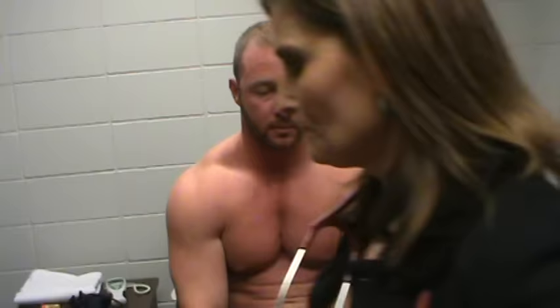All right, we've looked in your ears. Now what I want to do is a couple tests just to determine whether you've had any hearing loss. Do you have any problems hearing, Brian? No. Okay. One is called the Weber test, and what I'm going to do is strike this tuning fork and set it in the middle of your head, and I want you to tell me whether you can hear it equally in both ears, or whether you hear it in one ear more than the other, and which one you hear it more in, if you do. Does that make sense? Okay. All right. Here we go.